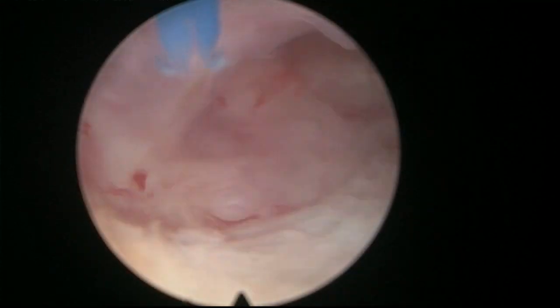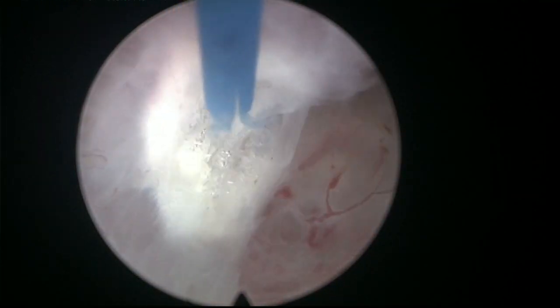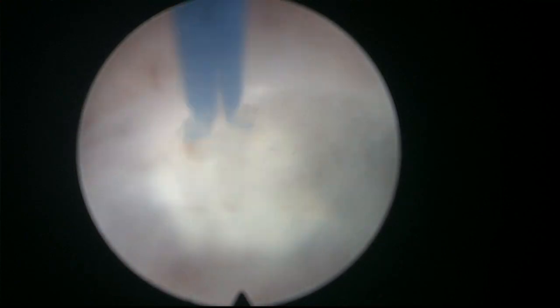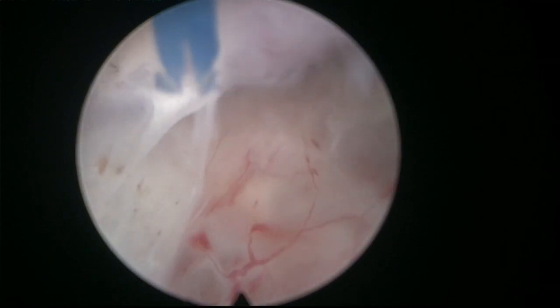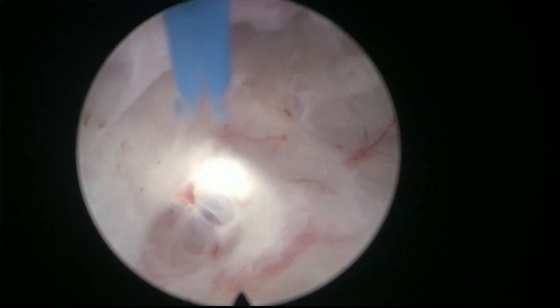See, when you come to this side, you see that we keep close. It doesn't matter if you leave a little bit of tissue there, because that's actually the capsule, what you're leaving, huh?